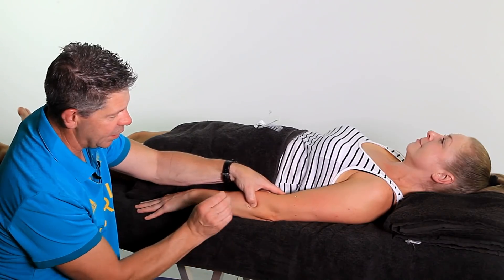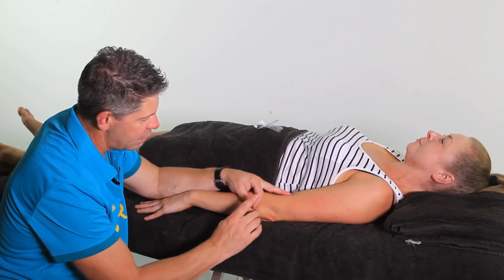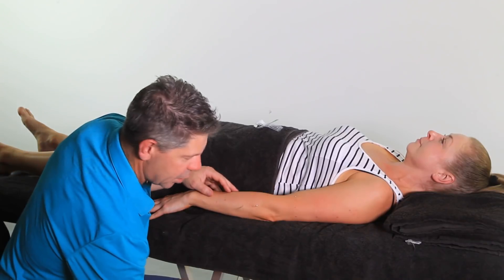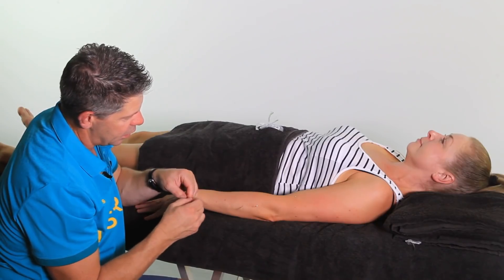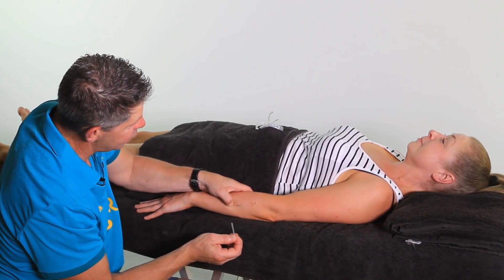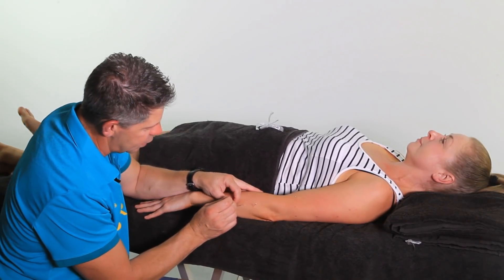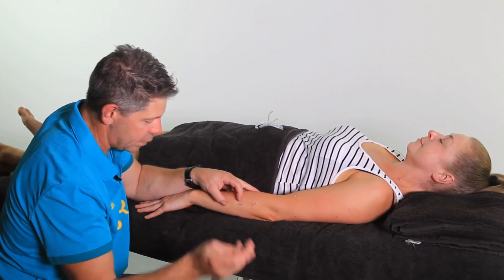You'll notice as I'm palpating, you'll see the needle moving. I'm going to come short at the musculotendinous junction once again, and then we're going to come a little bit inferior down from the main trigger point — just through here, tender there. So once again, in — and that's all we need to do.